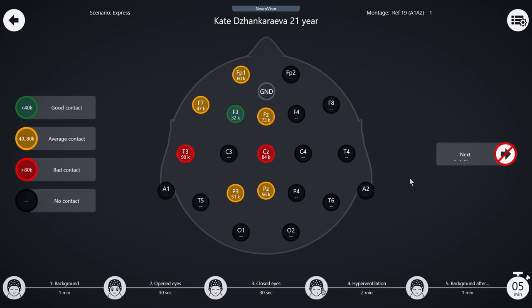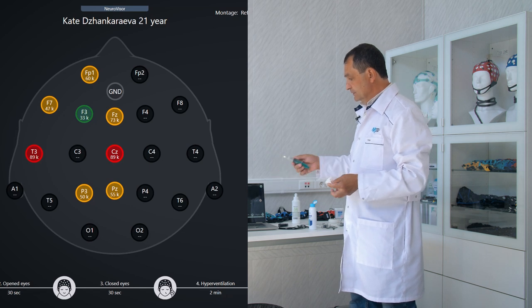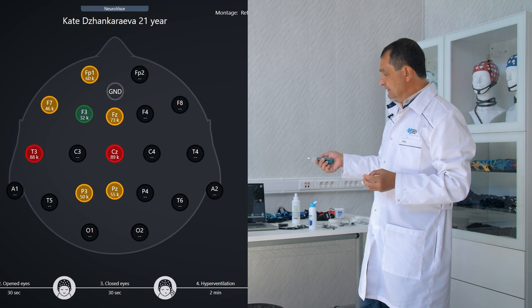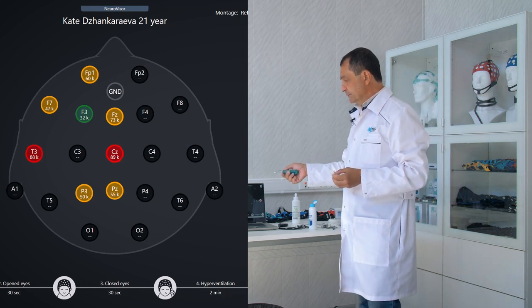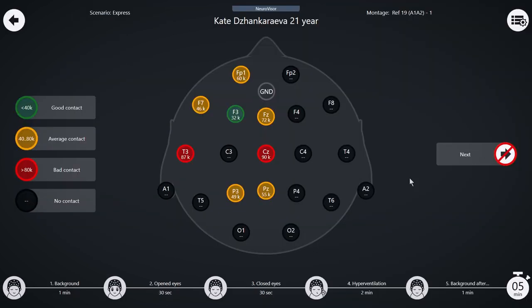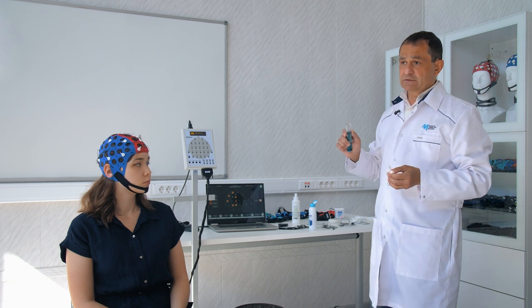In the impedance software module, we observe a schematic image of the head and the positions of the electrodes. Impedance levels are encoded with a specific color: green represents good impedance, yellow indicates satisfactory impedance, and red is a level that is too high. You need to achieve the levels encoded in green. The software of any manufacturer enables you to programmatically set these levels.